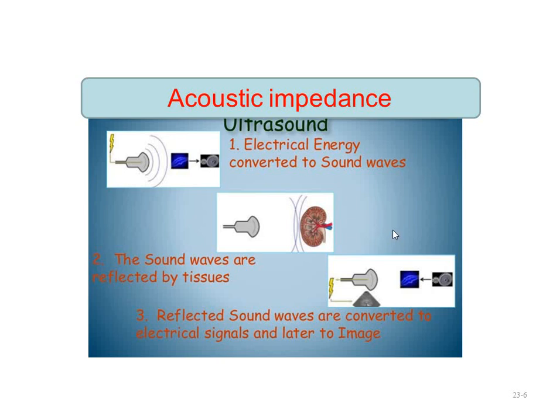However, in the present work of diagnostics and ultrasound imaging, the wave is incident and enters the body, then some is reflected from the tissue we want to study, and some is transmitted inside this organ or tissue. According to the value of reflection and transmission, we can get some information about the organ or the tissue.